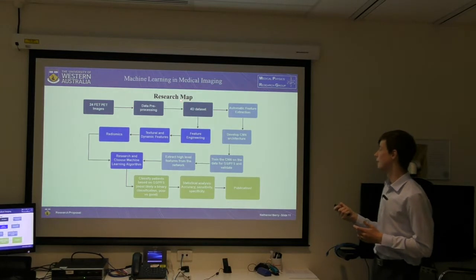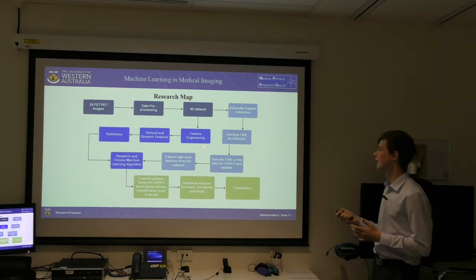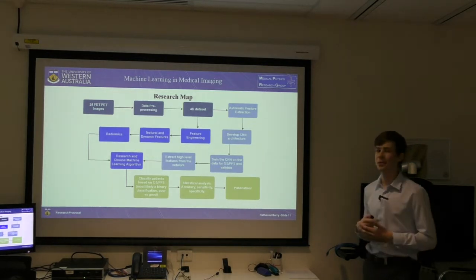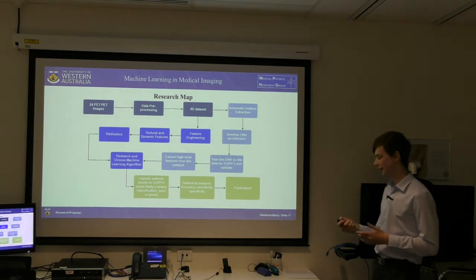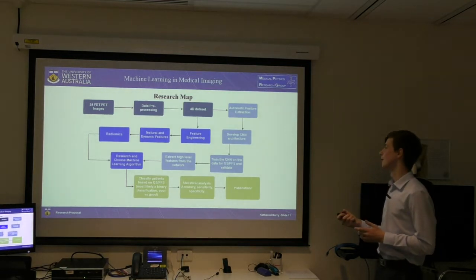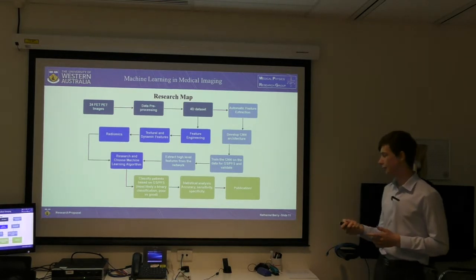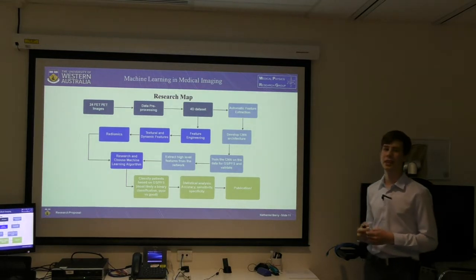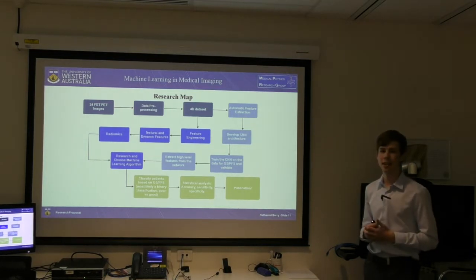And so here's our 4D data set. And from this 4D data set, we can try our hand at feature engineering, which is some of the features that I was just discussing. We probably have to comb through hundreds or even thousands of different features and put them through various algorithms to try and characterize our data well. And so we do that for our textural and dynamic imaging features, and then we can put that into our chosen machine learning algorithm. So we want to choose a machine learning algorithm that's specific for our type of problem.